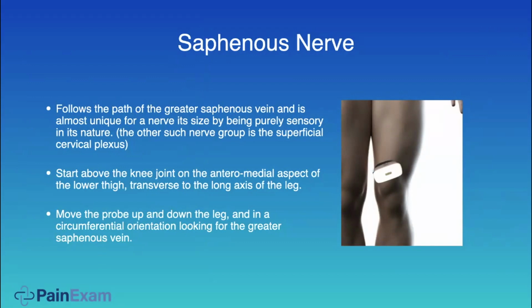Years ago, before there were genicular nerve blocks, which we'll talk about soon, I've had patients who came to my practice failing all sorts of knee interventions, steroid, viscosupplement, surgery, or they didn't want surgery. And being an anesthesiologist, a regional anesthesiologist, knowing the saphenous nerve does provide some innervation to the knee through the infrapatellar branch, I would do saphenous nerve blocks at the distal thigh, right where this probe is. Lo and behold, with using a local anesthetic and maybe 20 milligrams depomedrol at the time, this was about 10 years ago maybe, I was able to get 4 months or so of pain relief for many of my patients by doing this.